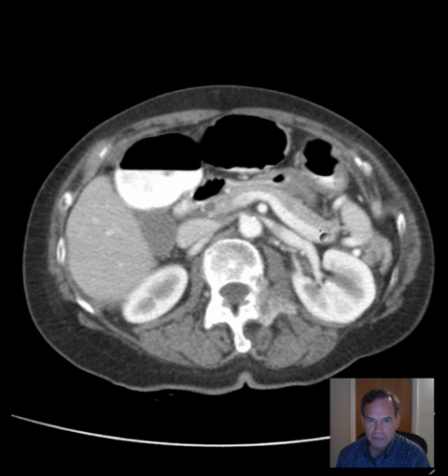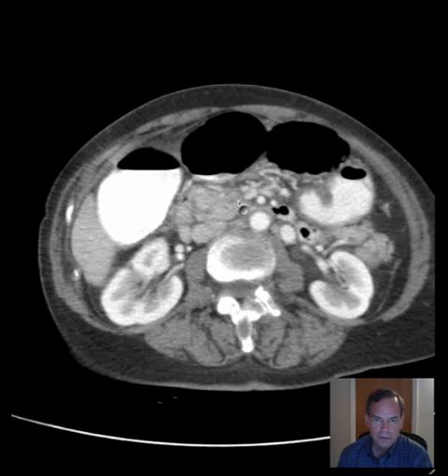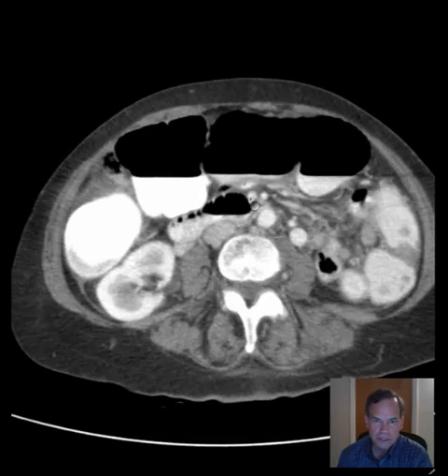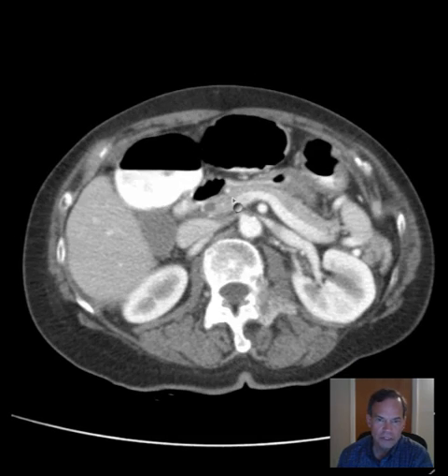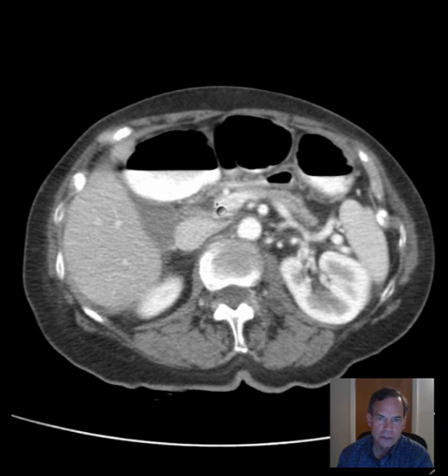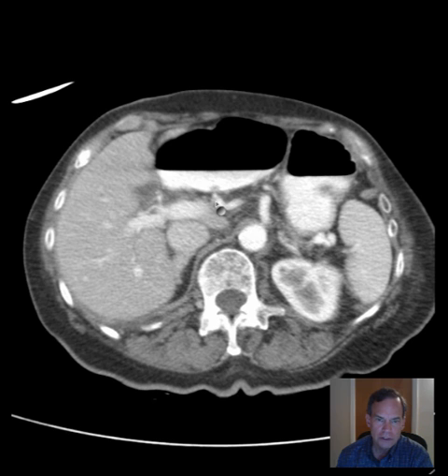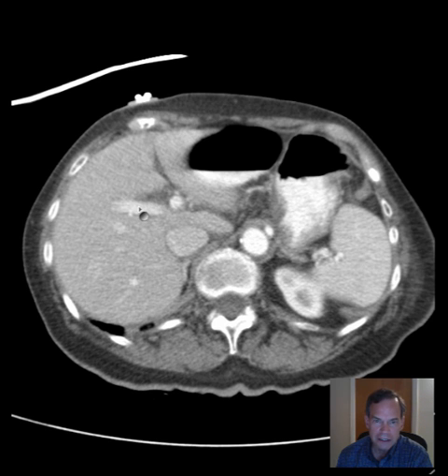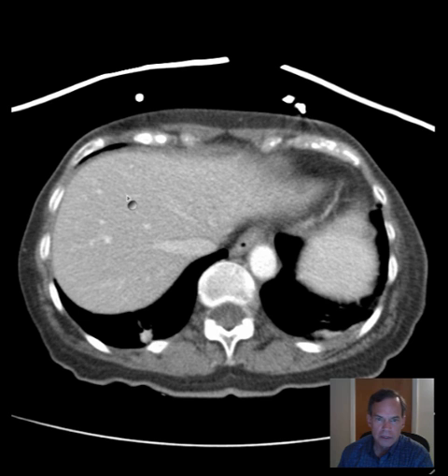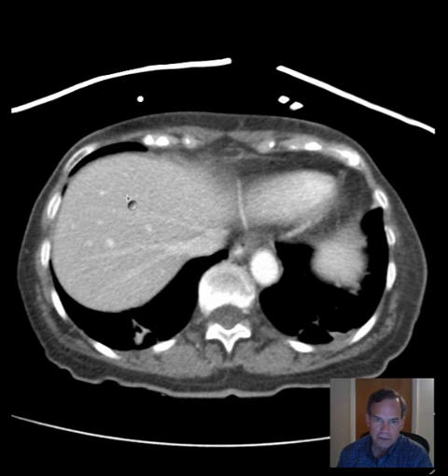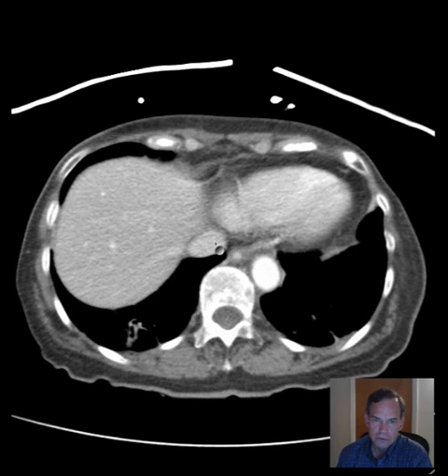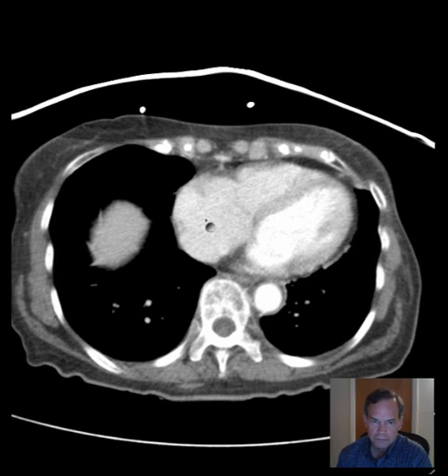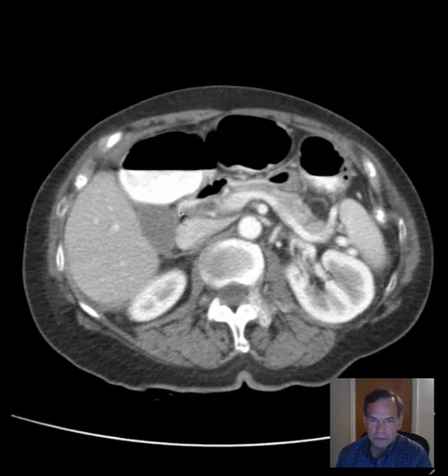This is the splenic vein. The splenic vein joins the superior mesenteric vein to form the portal vein, which then courses superiorly and to the right toward the liver, allowing portal venous return to flow into the liver. Subsequently, the hepatic veins drain venous blood from the liver into the inferior vena cava, which then goes to the right atrium.